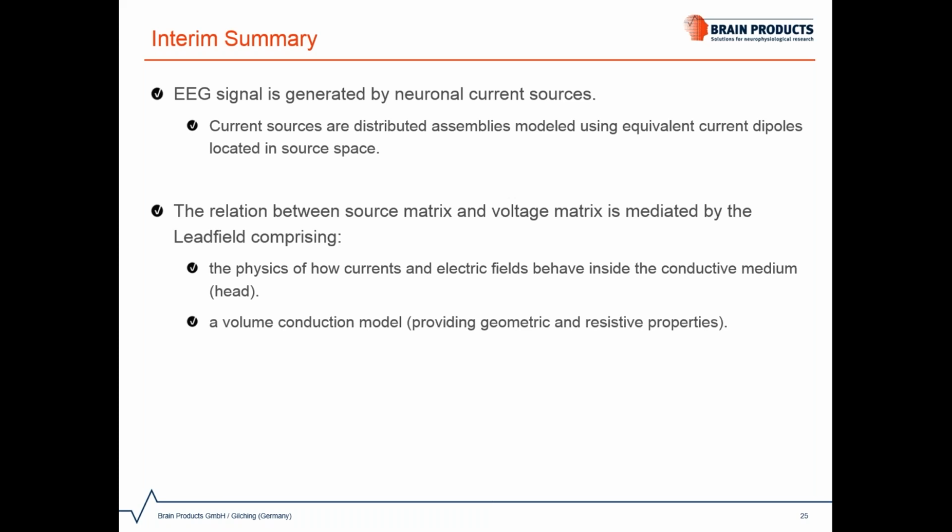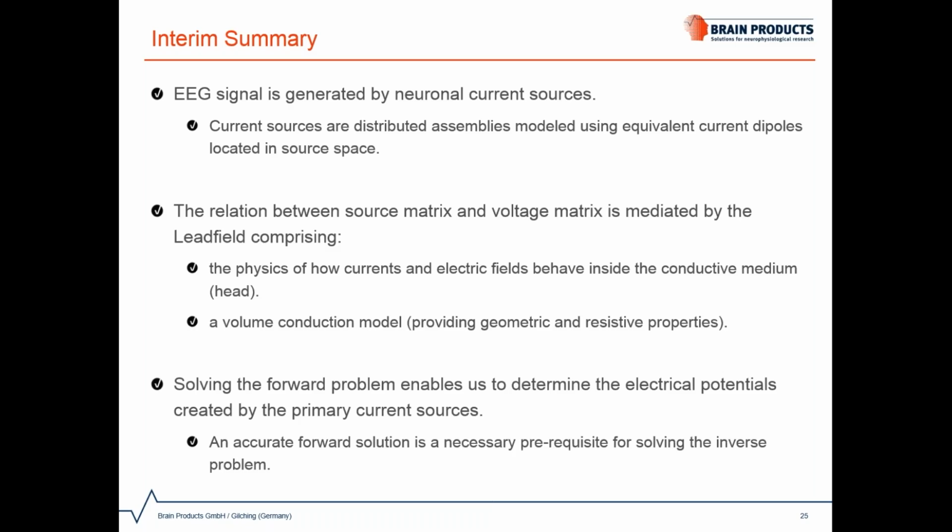So, what do you benefit from solving the forward problem? It enables you to calculate the potentials generated by the neuronal currents, which makes it a necessary prerequisite for solving the inverse problem.